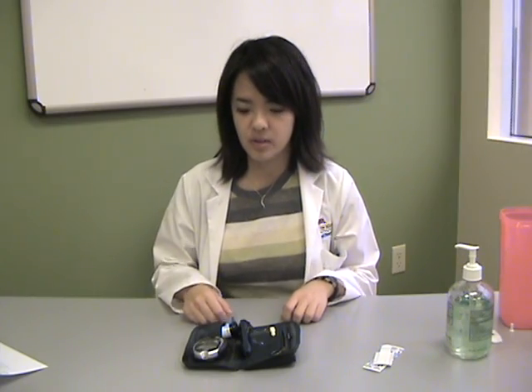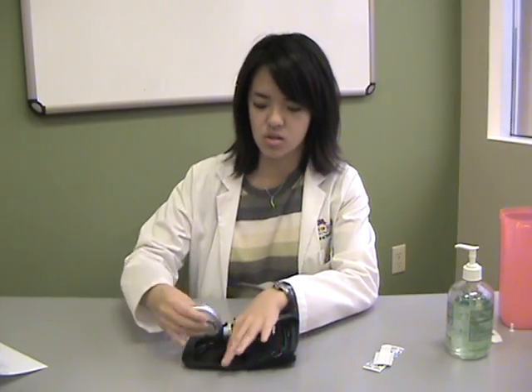How to use your one-touch glucometer. Every meter is different. Please ask your health care provider or pharmacist for specific instructions to your glucometer. For this demonstration, we will be using the One Touch Ultra-2 glucometer.